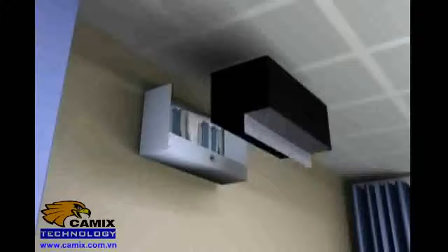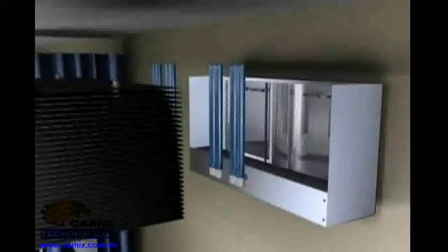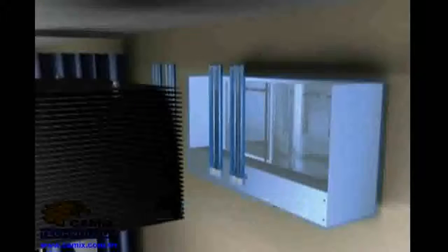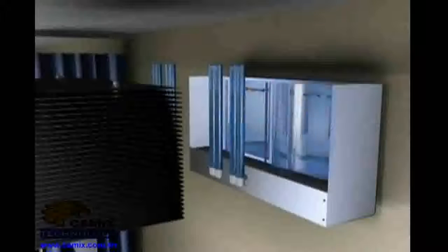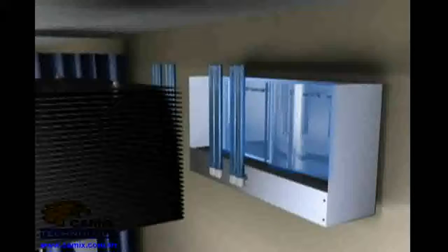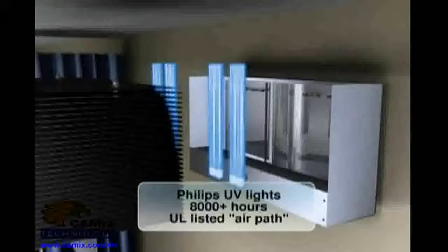The realization of the upper air system is very simple. UVC radiation is produced by the lamp and amplified by reflectors assembled at the back. The fins at the front ensure the light is directed parallel to the ceiling and that no light shines towards the ground. The use of long-life lamps and the simplicity of execution means limited maintenance with maximum reliability.